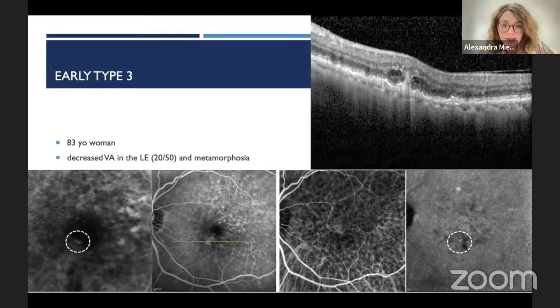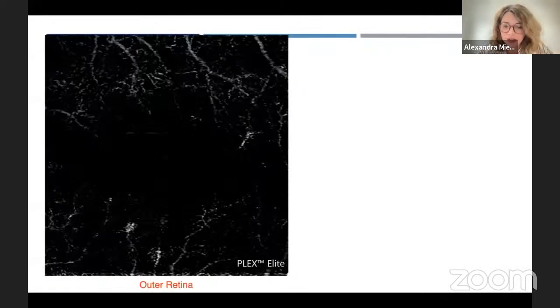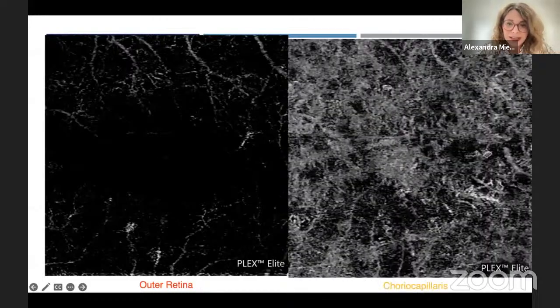So when passing a scan of OCT through this lesion, we can very nicely see that it corresponds to a hyperreflective intraretinal complex associated with some hyperreflective foci, but also with some intraretinal fluid. And when performing OCT angiography, interestingly, in the deep capillary plexus, we see here some very small high-flow vessels that will go downwards towards the outer retinal layer, towards the avascular layer, if you want, and form a tuft-shaped lesion that we can see here.